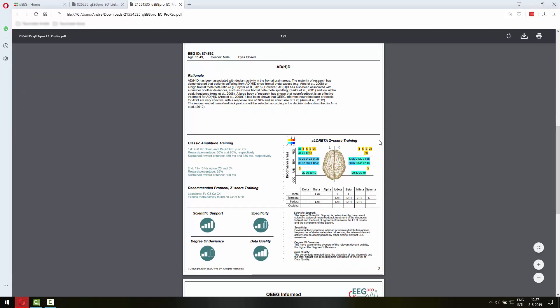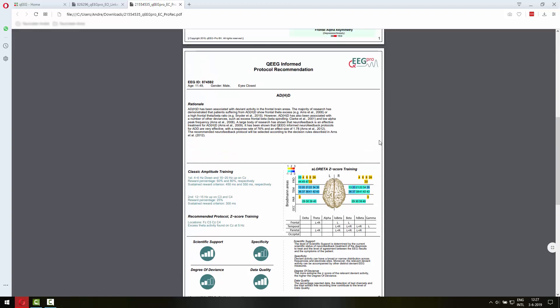Let's just first look at the protocol recommendation in the report. There was a protocol recommendation requested for ADHD and as you can see the recommended protocol is 4 to 6 Hz down and 15 to 20 Hz up on CZ.